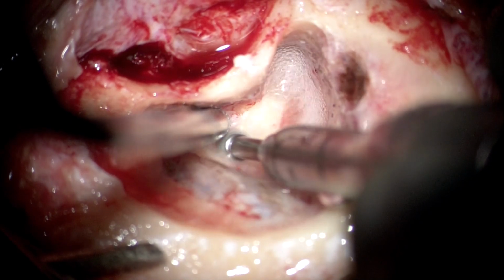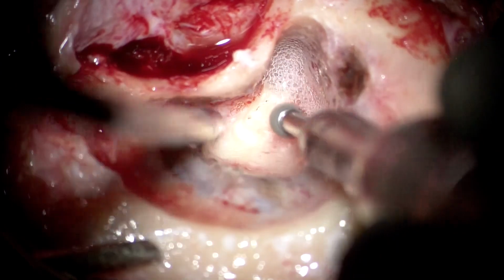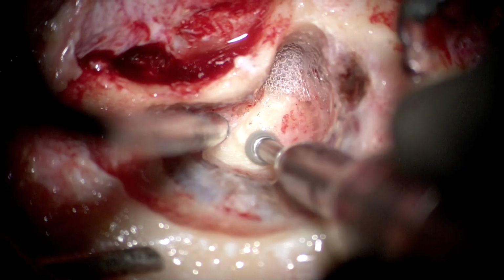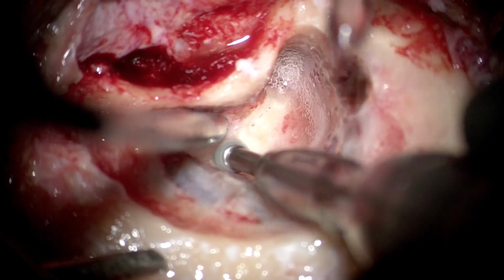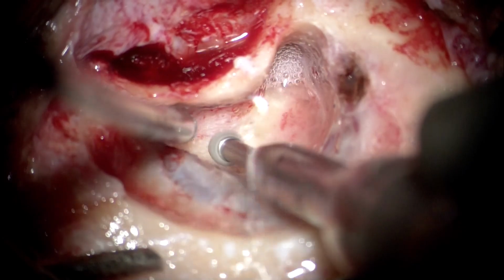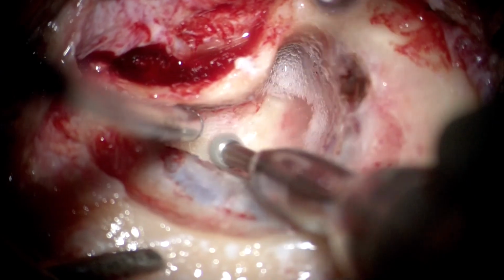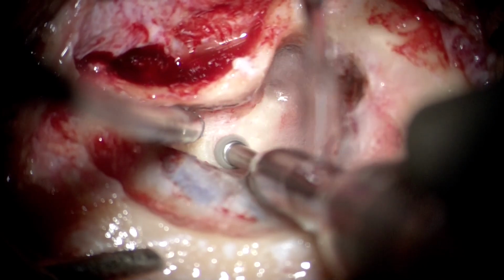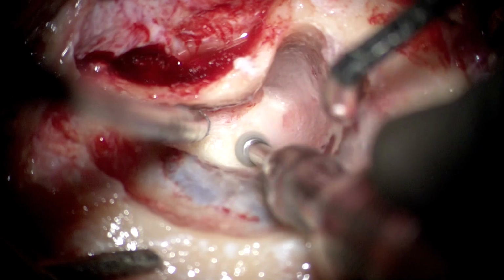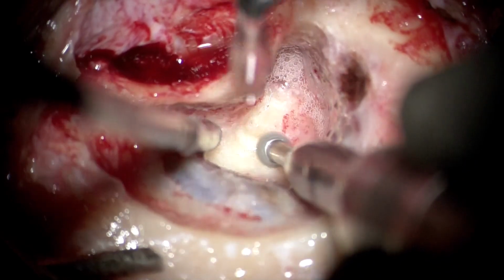So the lateral canal is now being drilled. And we can already see that part of it has been opened. Now we are going to drill the bone behind it to define the level of the posterior canal. The posterior canal is located quite inferiorly, and one must keep that in mind. It's also on a more medial aspect. I had already mentioned that the posterior ampulla lies medial to the vertical segment of the facial nerve. So a lot more bone has to be drilled to be able to define the posterior canal.